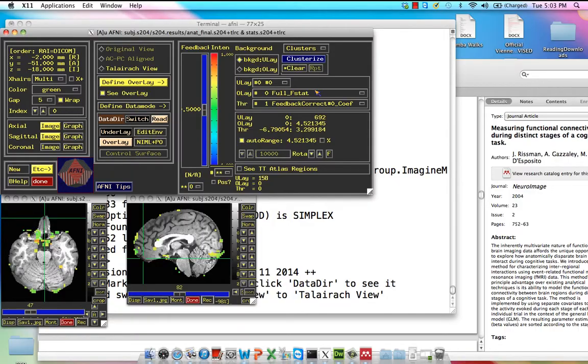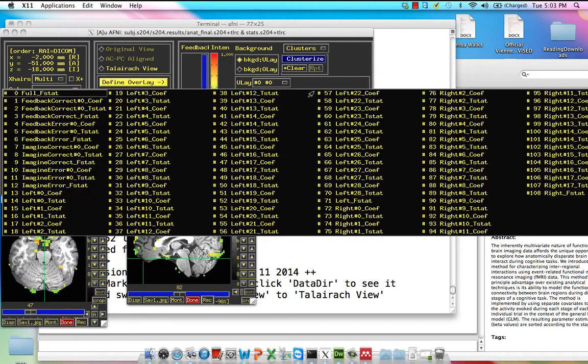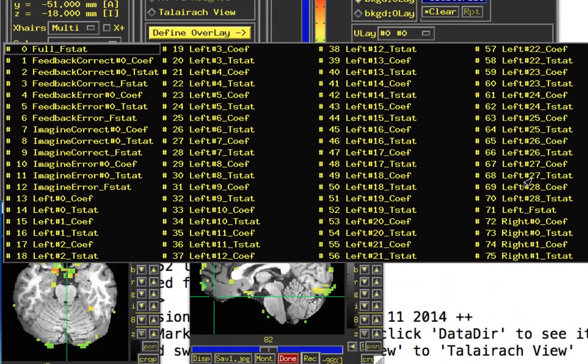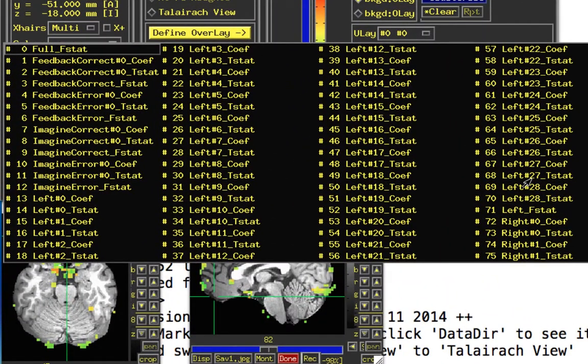Within this, we have a bunch of different things that have been output. Notice that there are many regressors here — that's because for each one, we had a bunch of different trials for that particular regressor. For the left button presses, for example, I have a total of 28 different instances of that occurring, and therefore, since I used stim_times_im, I have 28 individual beta weights.